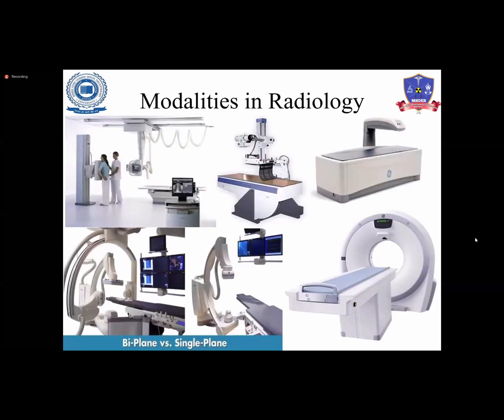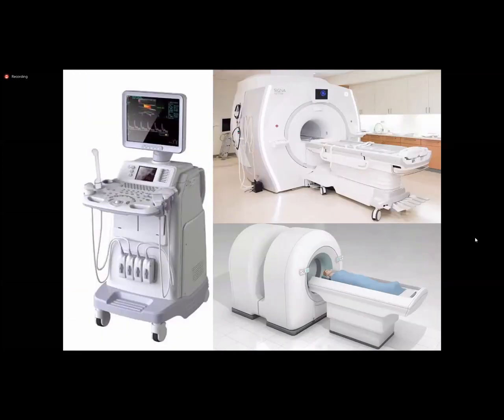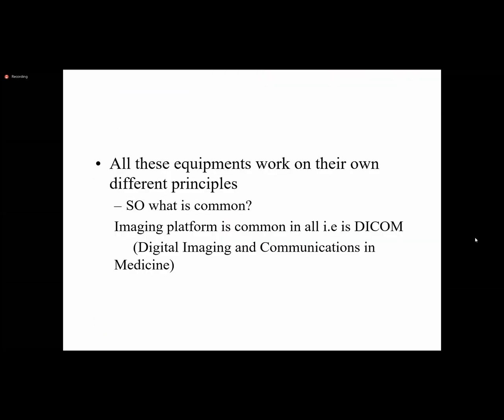These are the modalities we are working with nowadays in hospitals, or as we can say, in diagnostic centers. Here we have X-ray equipment, DR systems, IITV, DEXA, computed tomography, DSA, C-arms, biplanar and single planar. We also have sonography equipment, MRI and PET-CT scanners. All these equipments work on different principles. X-ray works on attenuation, MRI works on radio frequencies, and ultrasound works on sound waves. So what is common in all these equipments?